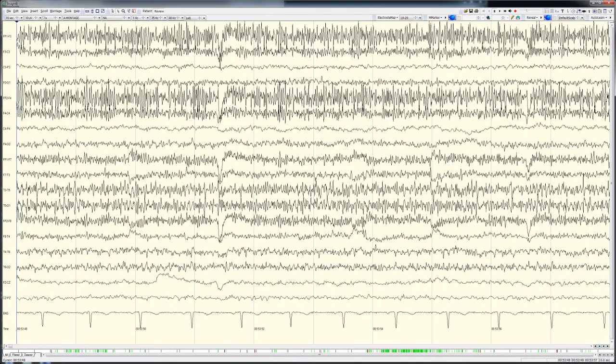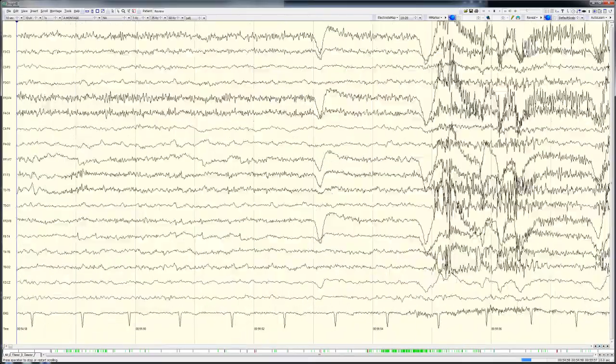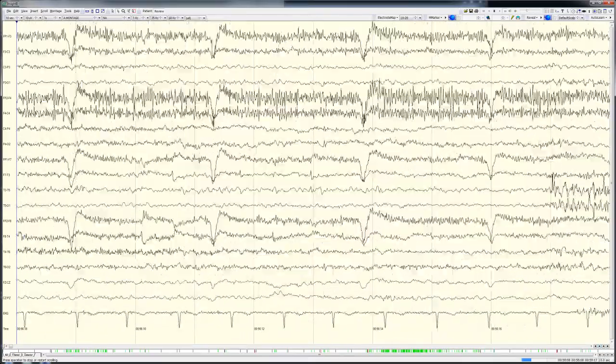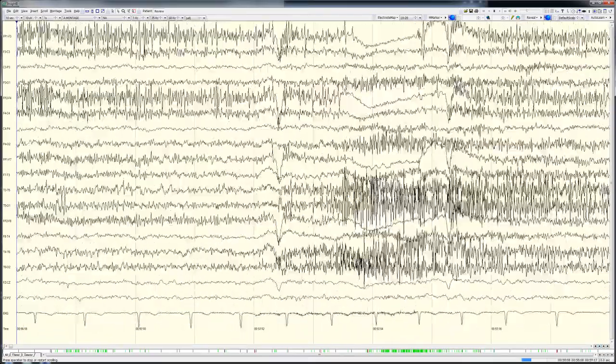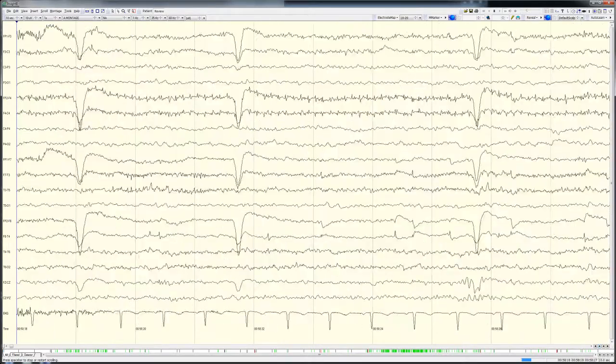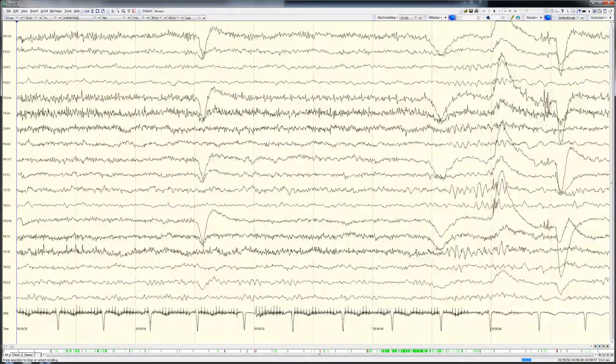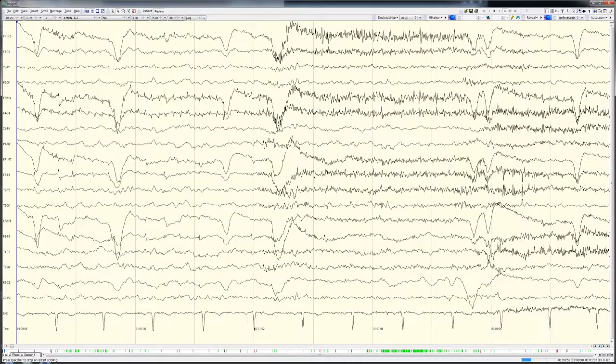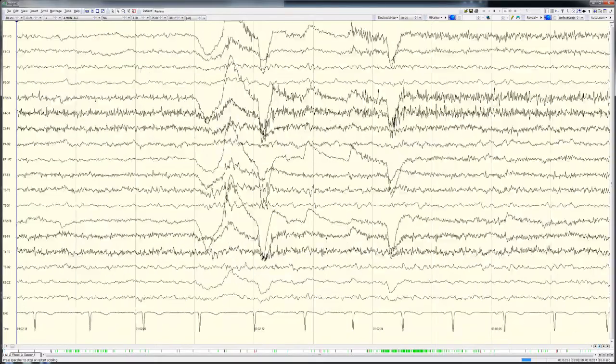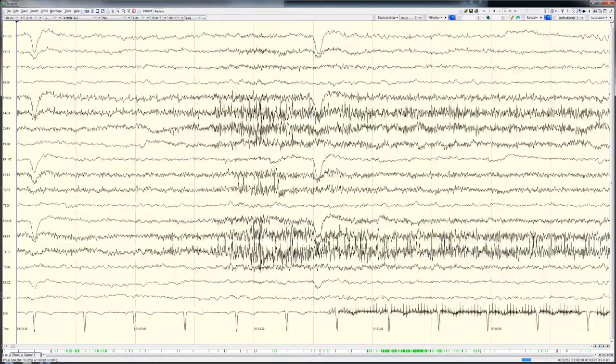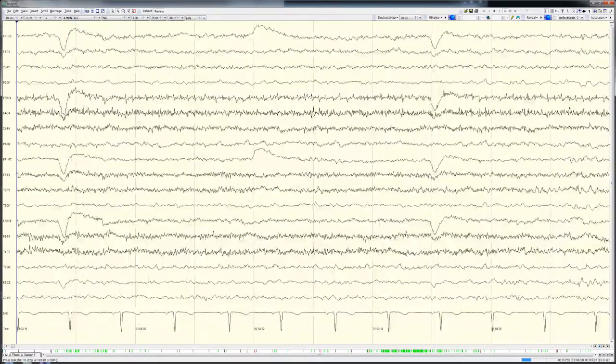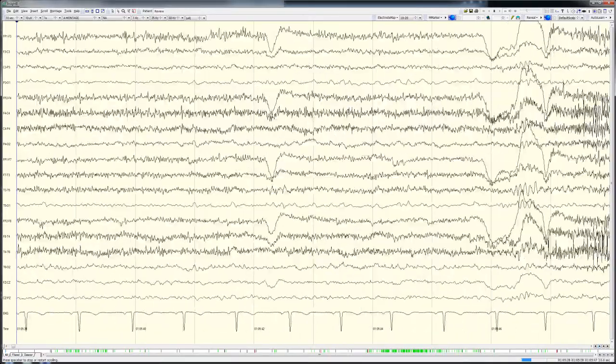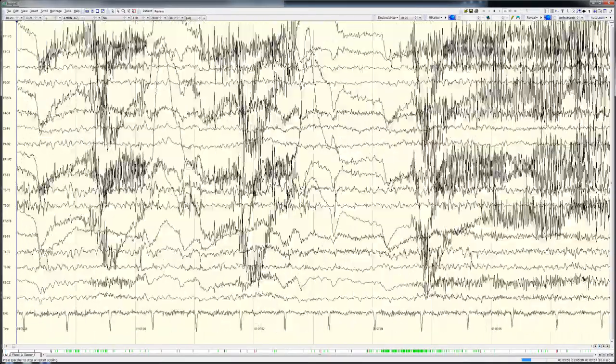In this example, I'll be performing an initial review of a 38-hour-long EEG obtained from a patient with medication-resistant epilepsy. But first, let's take a look at the most common method currently used for this type of EEG review. The entire EEG would be visually scanned at 40 to 60 times real speed. Here I'm showing a high-speed review occurring at 40 times real speed.